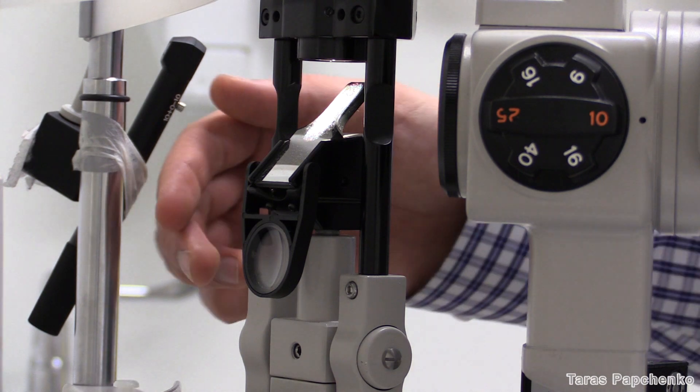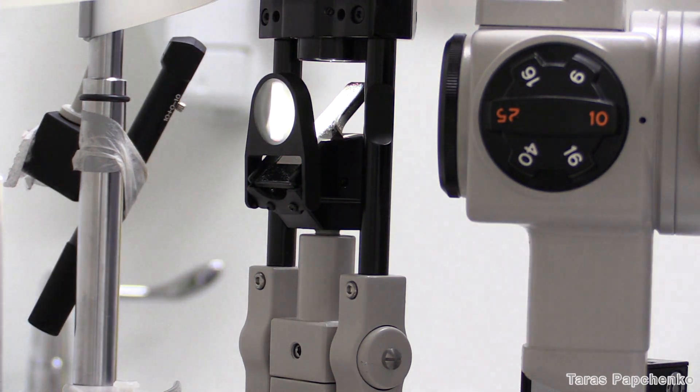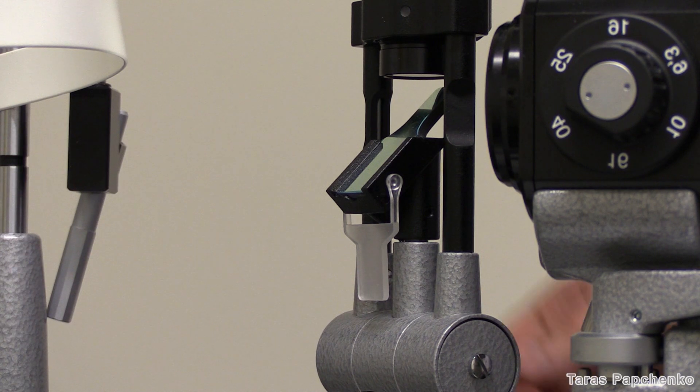First, flick the diffuser of the slit lamp into an upright position. It provides even illumination of the globe. Diffusers look different depending on the slit lamp you use.